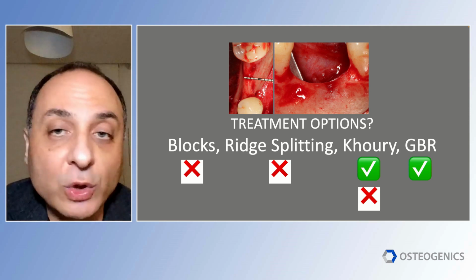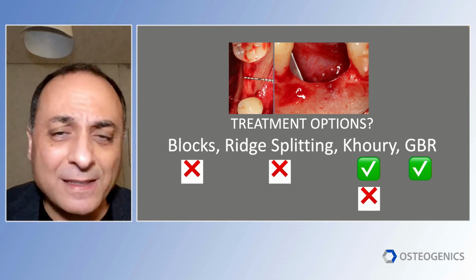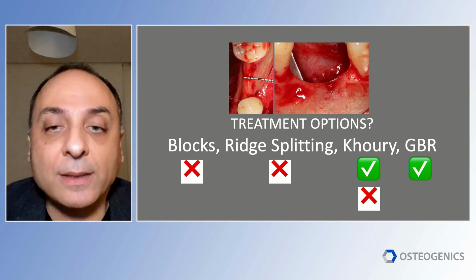When you're treating a totally edentulous case, you need to cut the patient on both sides. So this is a very invasive technique, very technique sensitive. It's a good technique, but I personally stopped doing it.